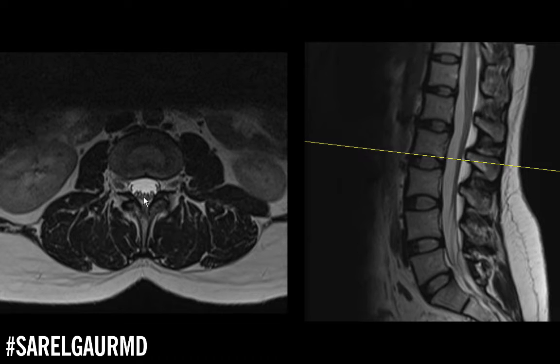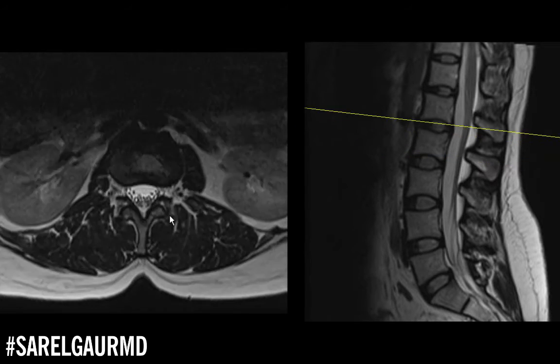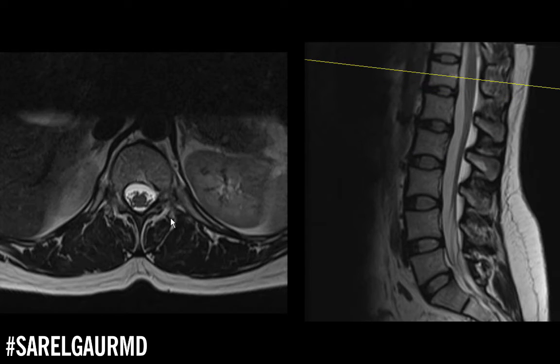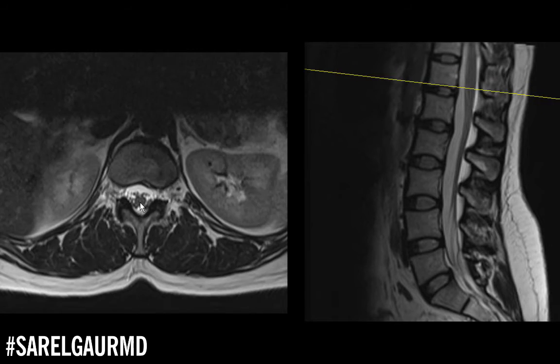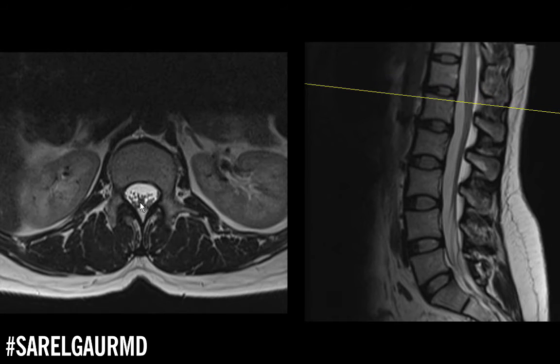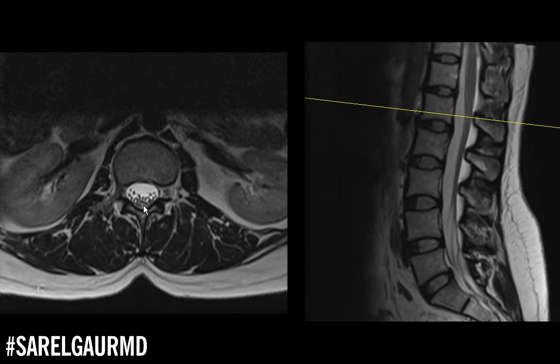Let's focus on the central canal to start. In the central canal, we're going to have a portion of the spinal cord — this is the spinal cord here. As we go lower, or caudally, we're going to see that spinal cord terminate, and we're going to get these nice rows of nerve roots floating in this white CSF.